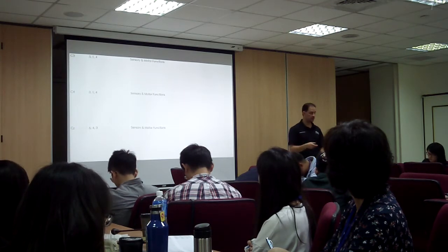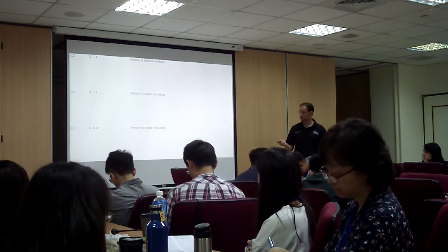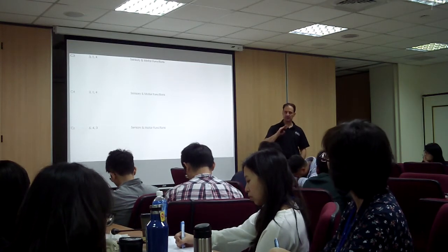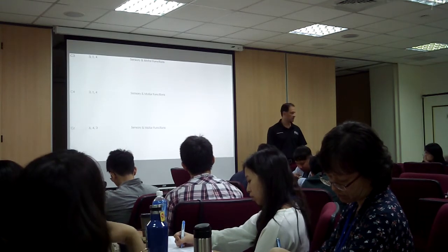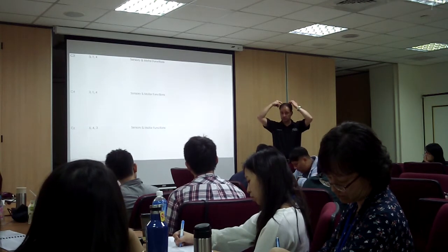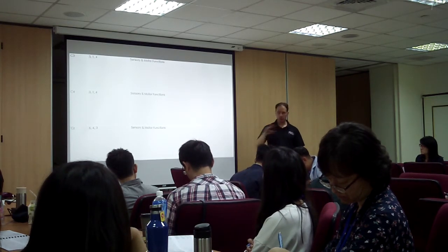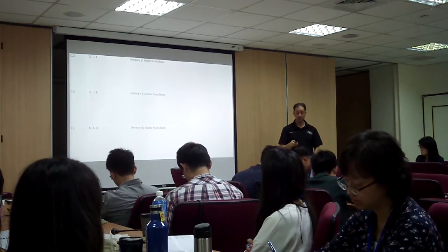Okay? And when we look at the EEGs, we're going to see those. It's very important. So what you do is you target the mu, and mu is usually in the range of 10 to 11 hertz. That's usually the frequency, 10 to 11. So put a sensor on C3, put a sensor on C4, and you squash that mu. You don't touch anything else. Do not reward anything, just squash and downtrain the mu. That's very important to know.